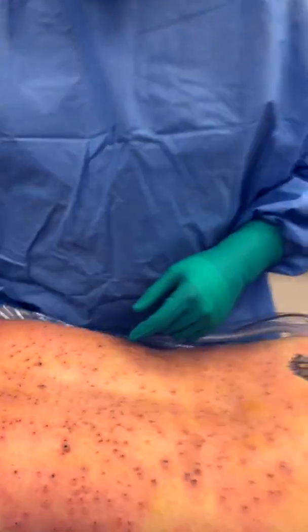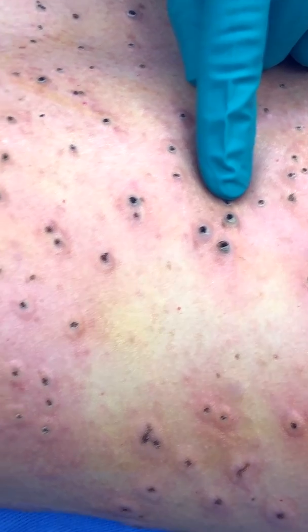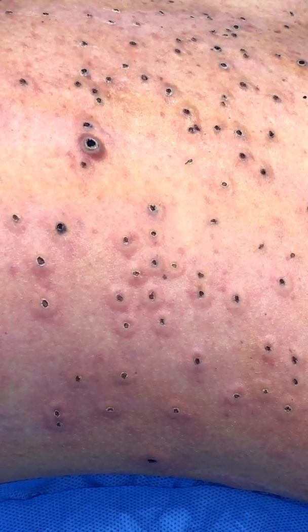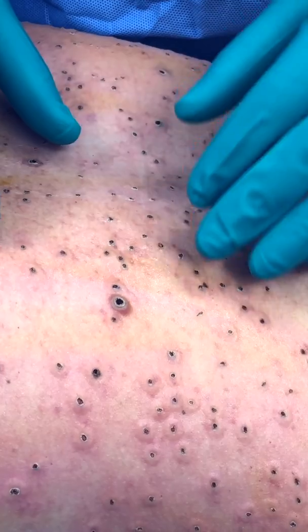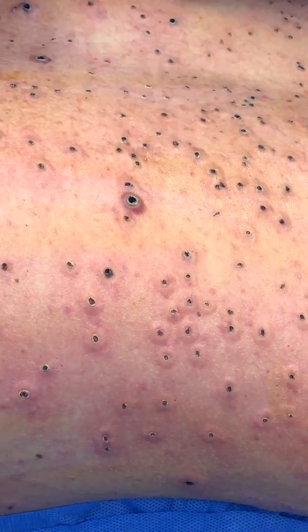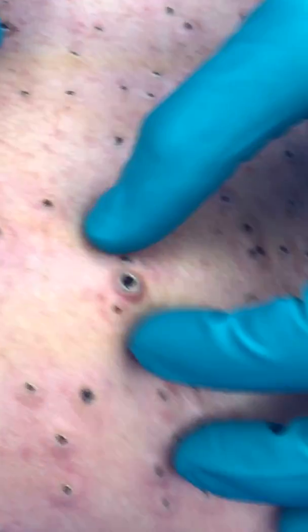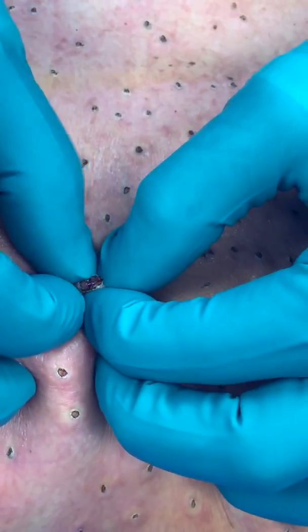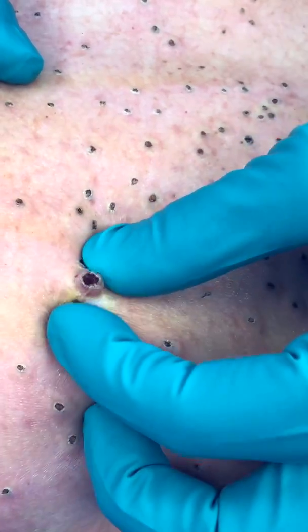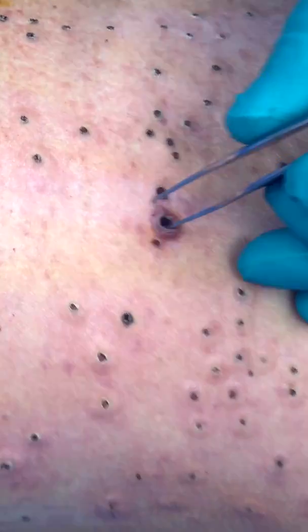Looking here at bumps treated with electro desiccation that aren't quite as flat as the rest — the surrounding skin has a halo of raised skin, like a hive from an allergy. That's from histamine release from the tumor itself. Neurofibromas will release histamine and cause a skin reaction wherever you create damage to the neurofibroma. For this particular bump it didn't go down, and squeezing around it I can sense there's still something underneath — a little root left — so I'll squeeze to see if it wants to come out.